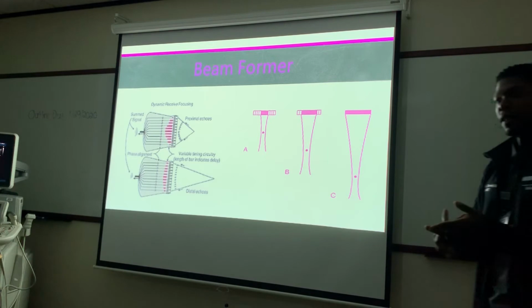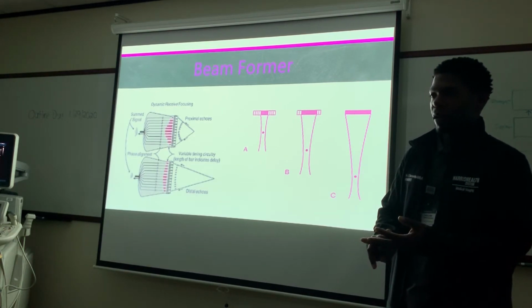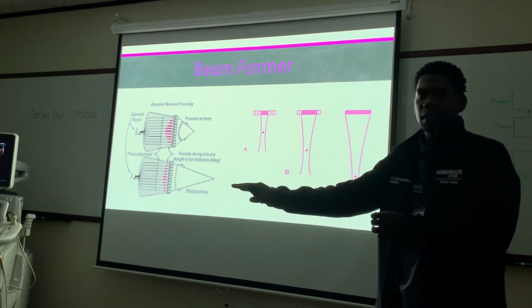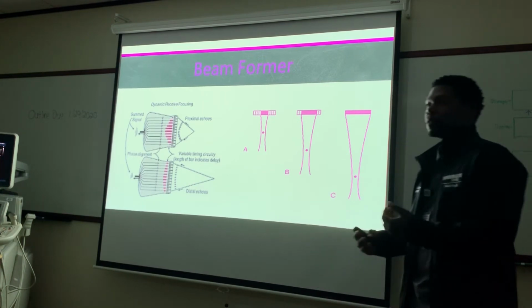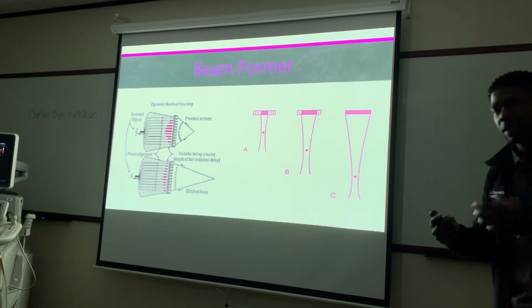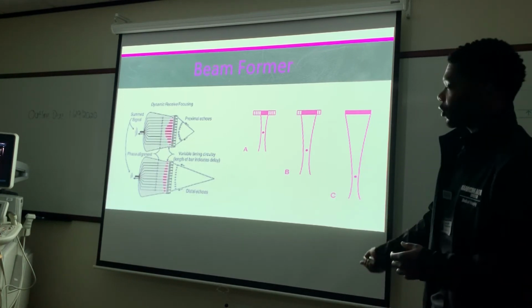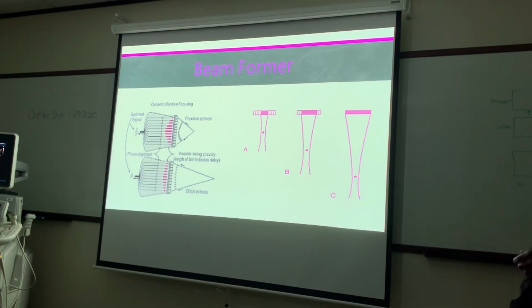It's controlling the steering and the apodization, right? Because it's going to control those complex signals being sent to the active elements. And during reception, after those active elements get hit by the reflected sound waves, they're going to turn into electrical signals, right? When they come back, the beamformer is going to effectively control dynamic receive focusing, and it's going to control the aperture.